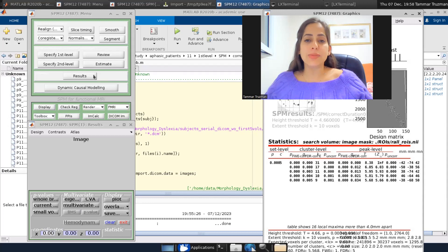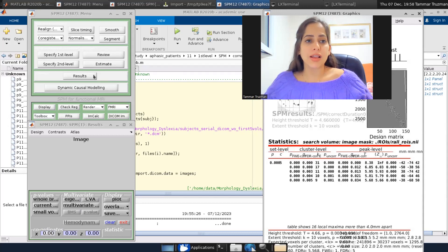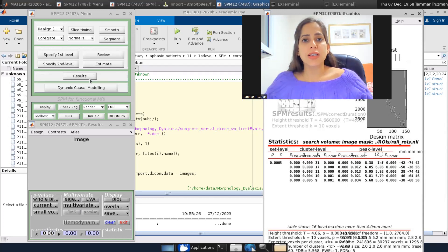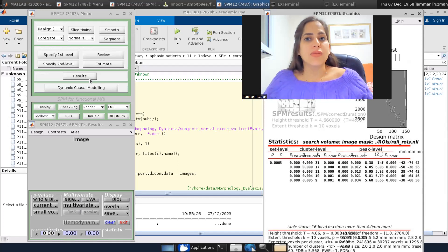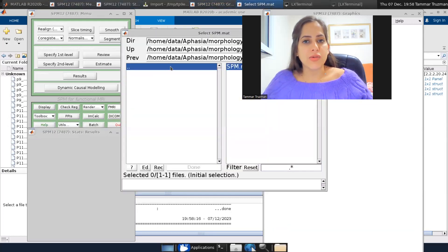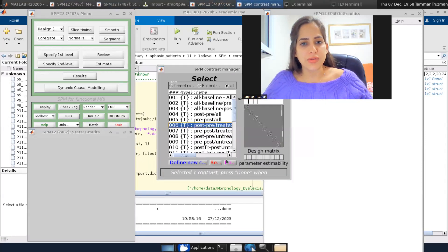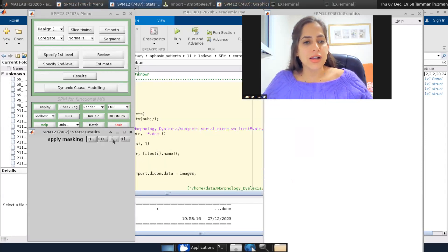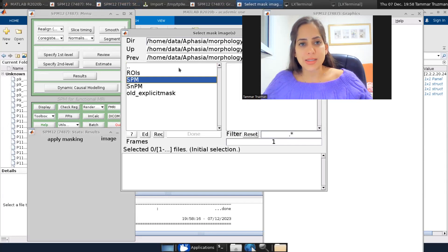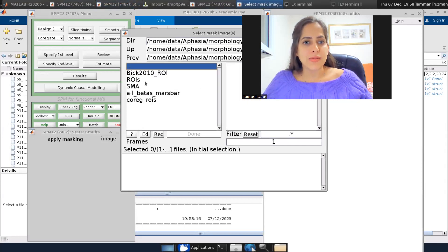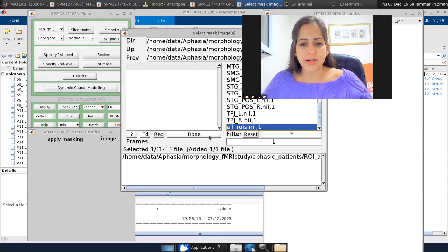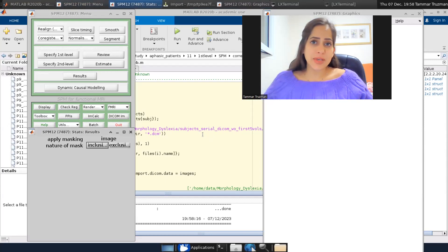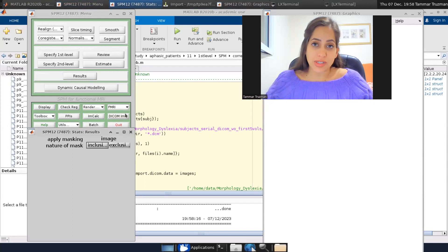what I'll do, I'll just add an explicit mask during loading the results. I'll add an explicit mask and I'll receive only the voxels that pass this threshold, corrected threshold that I'm interested in. So I will again load my contrast and I'll choose an explicit mask of my ROIs. So explicit mask means it doesn't do anything. It just masks out the voxels that I'm not interested in looking at.